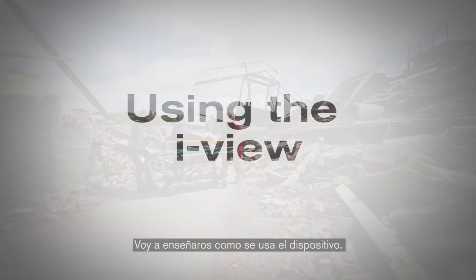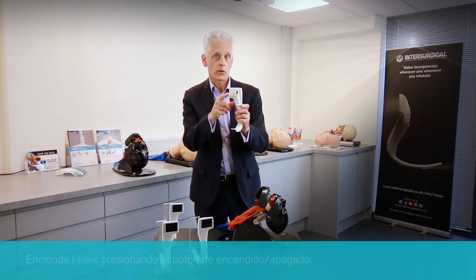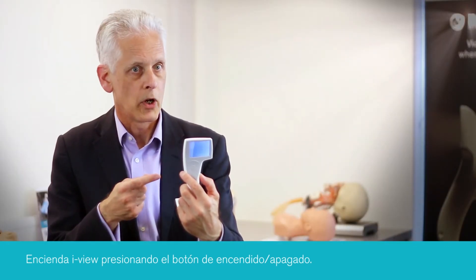I'm now going to show you how to use the device. To turn it on, you simply depress the on-off switch which is at the back of the device. After a couple of seconds you get the InterSurgical screen and then it will be operational.